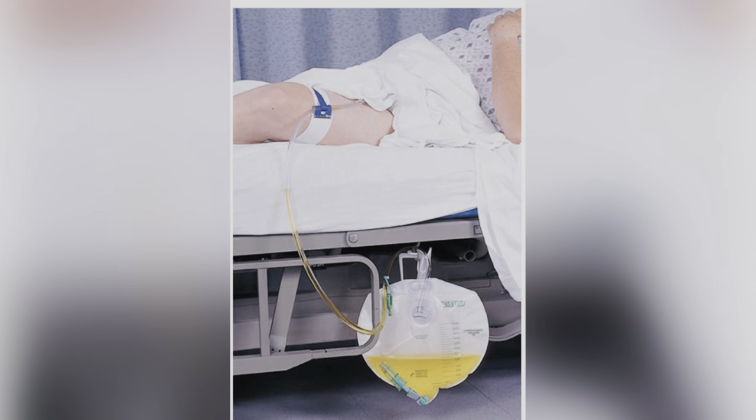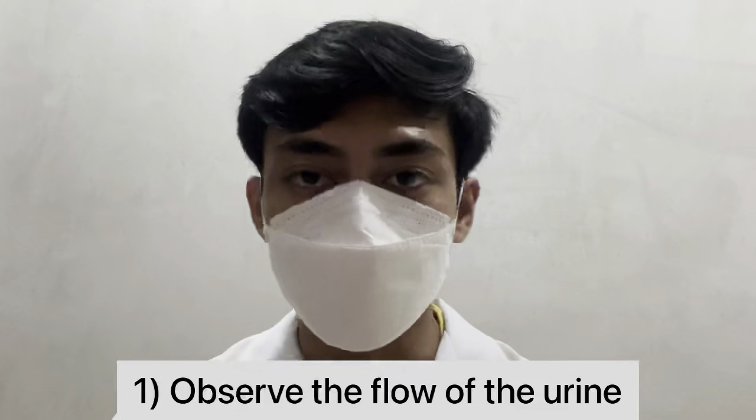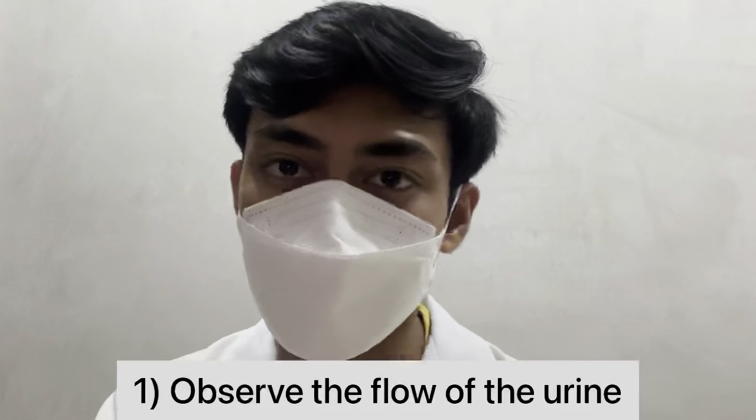The bag must also be attached to the frame of the bed instead of the rails. Make sure the tube is attached to the bed sheet and prevent the patient from lying on the tube. This might cause blockage of the tube. As a nurse, you need to pay a lot of attention to the patient and observe any changes or complaints from them. For example, if you observe that the urine is not flowing properly, then you might need to inform the nurse because there could be a blockage inside the catheter.